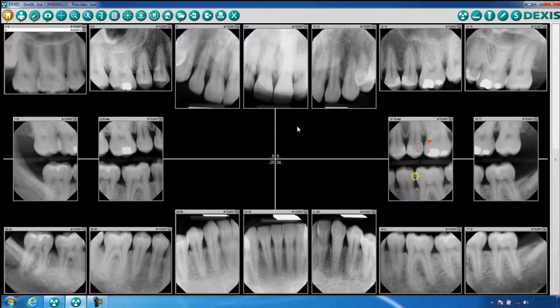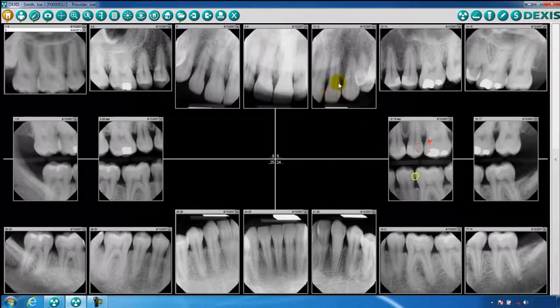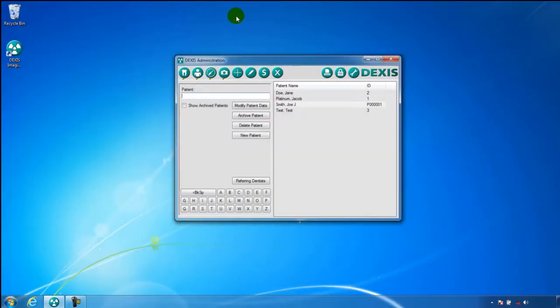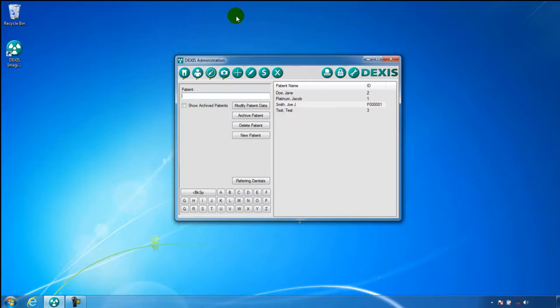The buttons at the far right corner are similar to the Windows functions of Minimize, Maximize, and Close. You may also close the DEXIS screen by clicking on the X icon on the toolbar. This concludes the training overview of the patient screen.